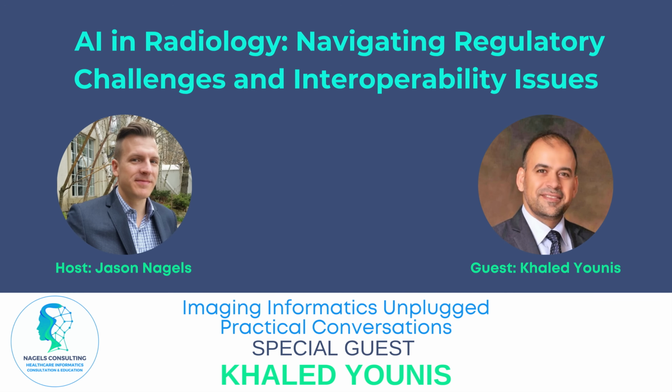So what that does is ensure that you have generalizability, you're maintaining the privacy, and you're adhering to all of the requirements, compliance with HIPAA, GDPR, and local IRBs in hospitals. And we noticed that it also improves the performance of the model rather than training on a centralized data set.